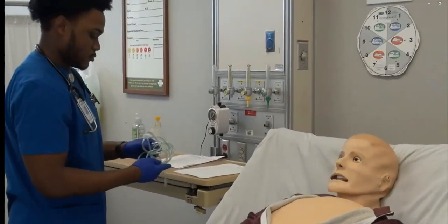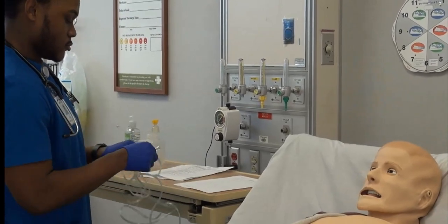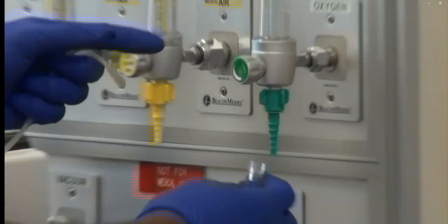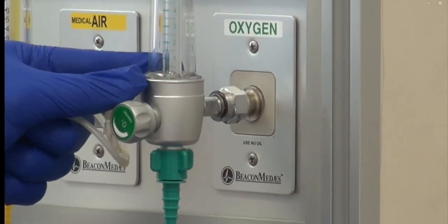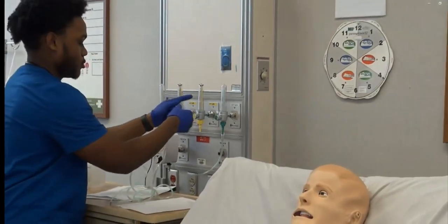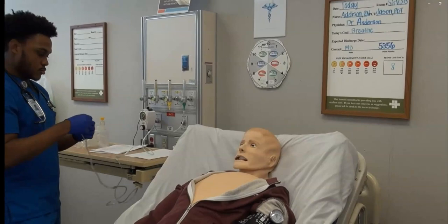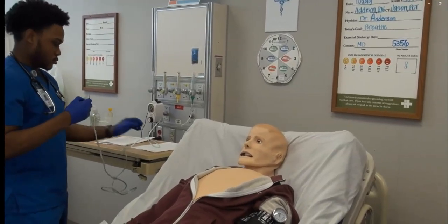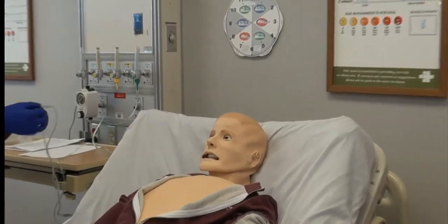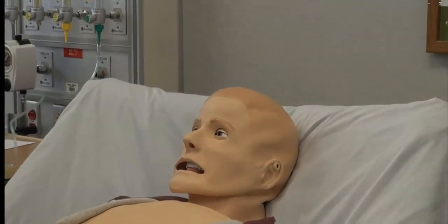Now the student is going to connect the tubing from the oxygen supply to the tubing on the cannula. Notice how the student is careful not to let the part of the equipment that goes in the patient's nose touch any surfaces. Now he has cut the oxygen supply on and regulated the gauge to the correct liter flow. Now he is checking to ensure that oxygen is flowing before he applies the nasal cannula.